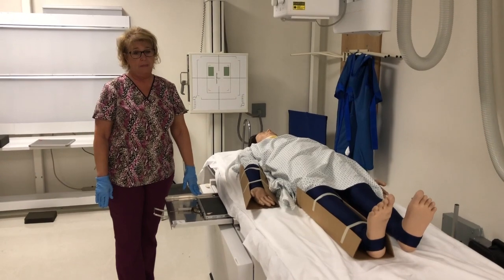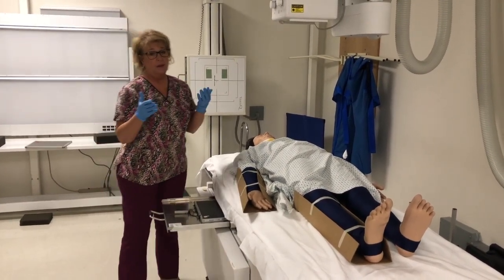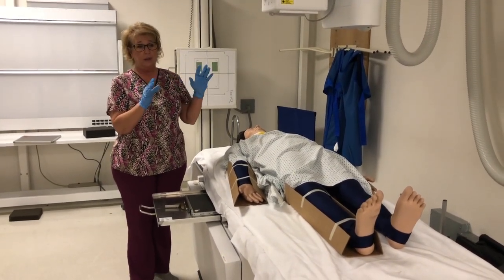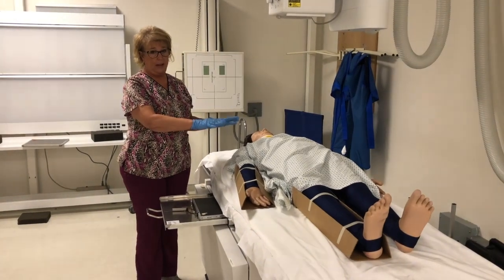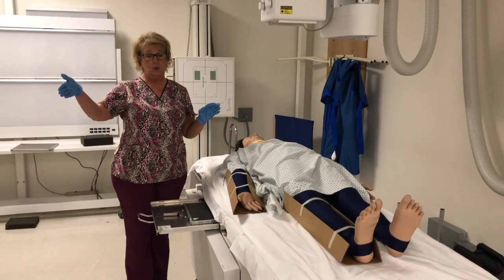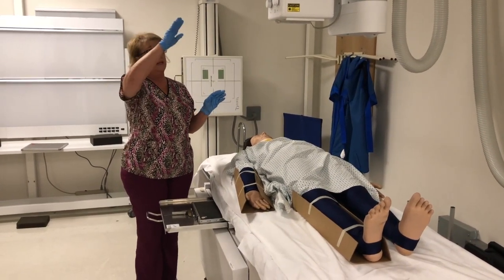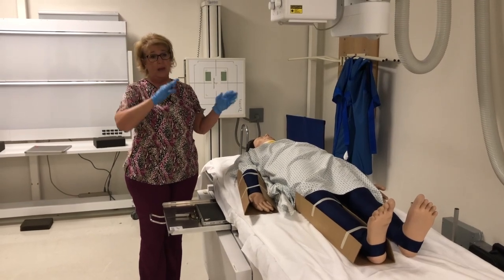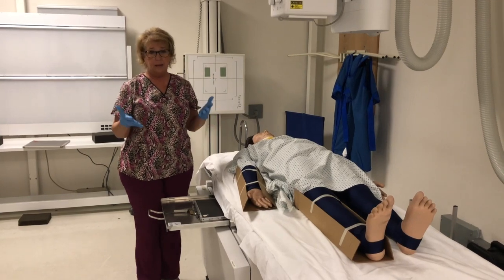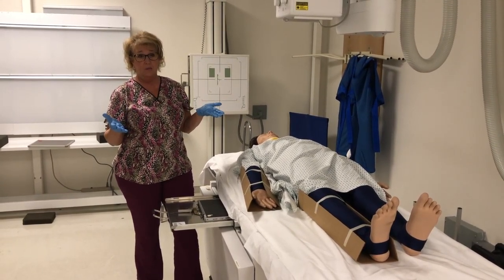One thing to always keep in mind too is that you would normally have a clean tech and a dirty tech. Someone who is just dealing with the patient and touching them, and someone who is behind the control panel setting techniques and possibly positioning the tube. That way you're not constantly changing your gloves. Now, I'm not going to demonstrate a glove change, but I will talk about it when it's appropriate.